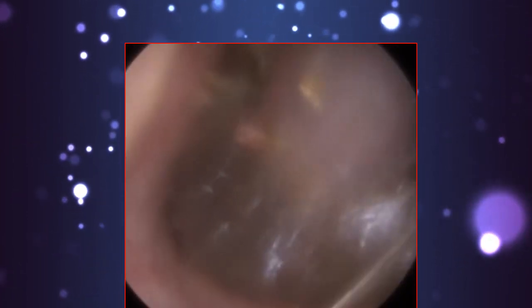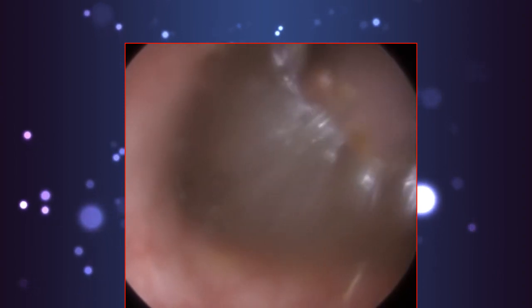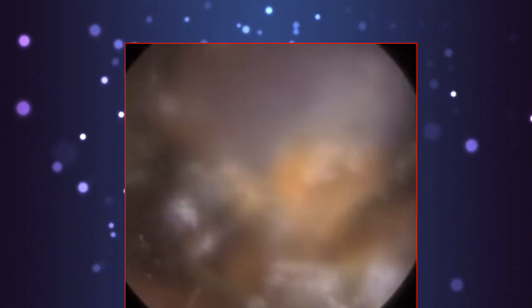So when I train the clear wax delegates, I always say, just try to get through the hairs if you can, get through the door, get through the entrance of the ear. Sometimes it's hard because the ear is very narrow, and these hairs are almost like whiskers, they're very thick. Some people ask, why don't we cut them? Well, cutting it might improve the views ever so slightly, but as you can see, it's not really impacting my view. It can sometimes just be a bit annoying when you are watching it, but it's not preventing me from removing the wax. And when you cut these hairs, they're just going to come back anyway, and come back very quickly. Sometimes they can come back thicker.